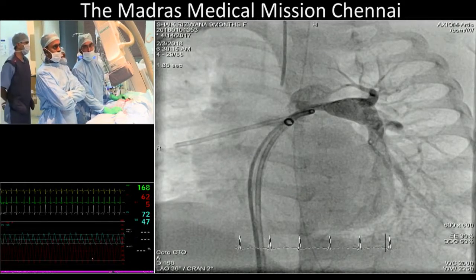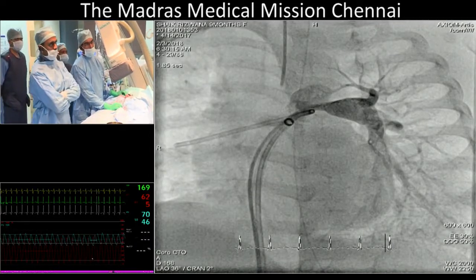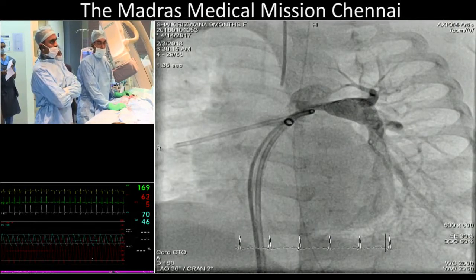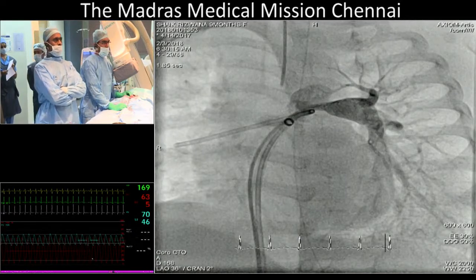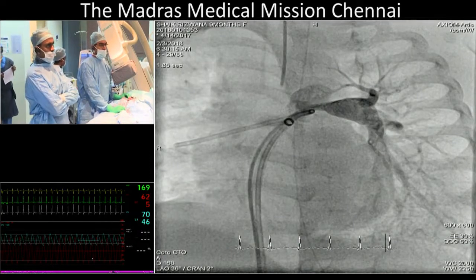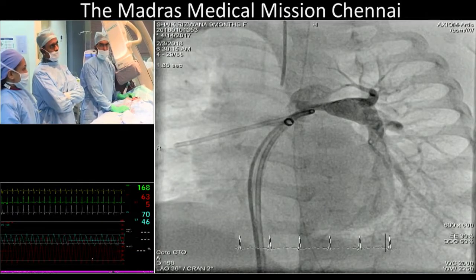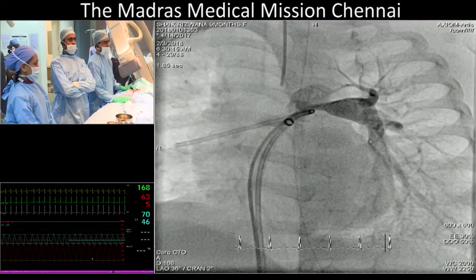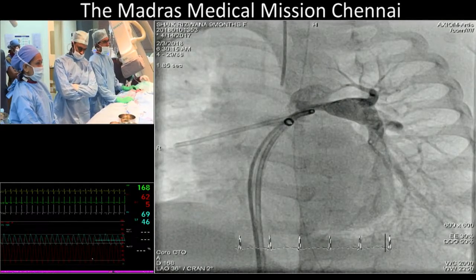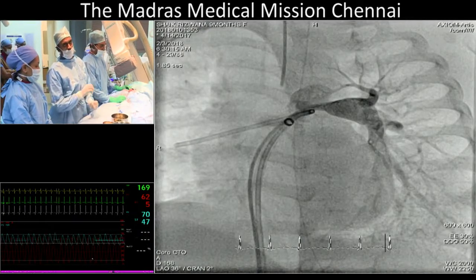I think in Williams syndrome, generally, you want to reduce your intervention as far as possible because they are quite touchy and unpredictable. So the opinion at this end is that it's a horrible disease. Some of the Williams syndrome branch pulmonary artery stenoses get better on their own. Others, you try to avoid stenting as much as possible. So a fairly different message to what you were saying. But tell us your progress and what your plans are. The consensus from the hall is we should try a balloon dilatation.